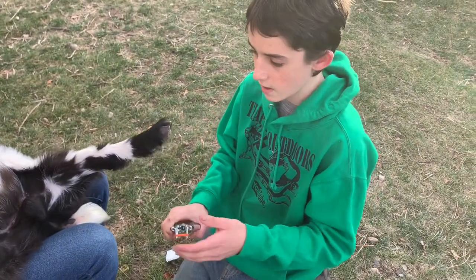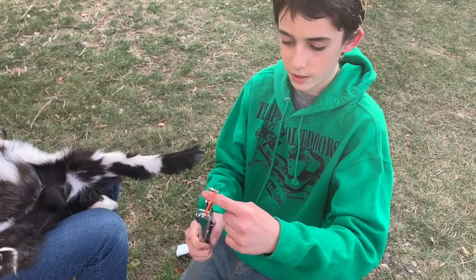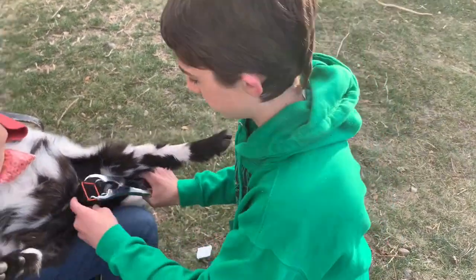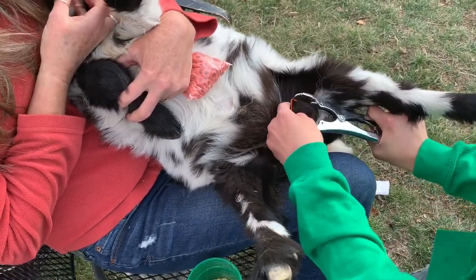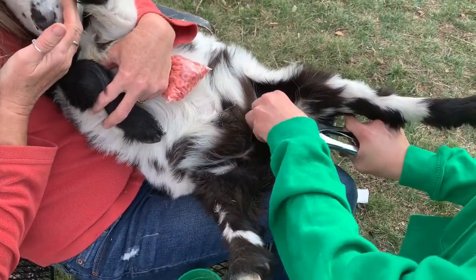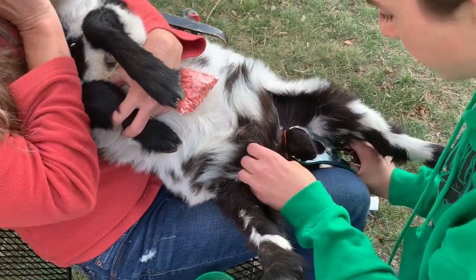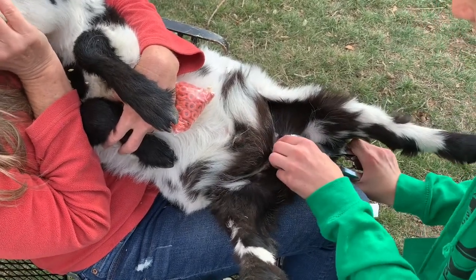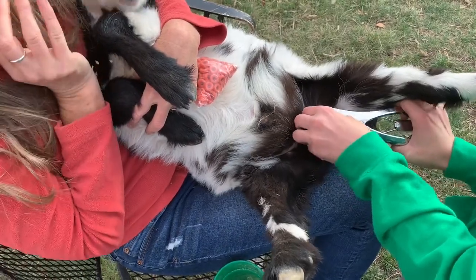Then you're gonna take your bander here, open it up, and you want to put it on this way because if you put it on the other way it won't slide off. So you just take this, get it through there, make sure that his teats right here aren't in it, and then you're just gonna want to slide it — make sure it's all the way up.